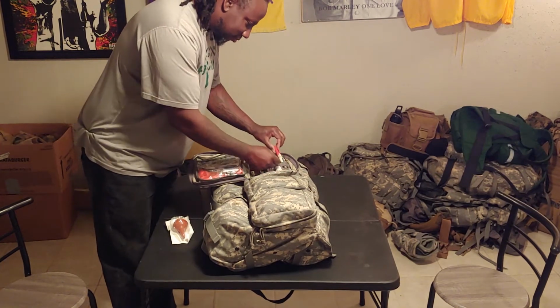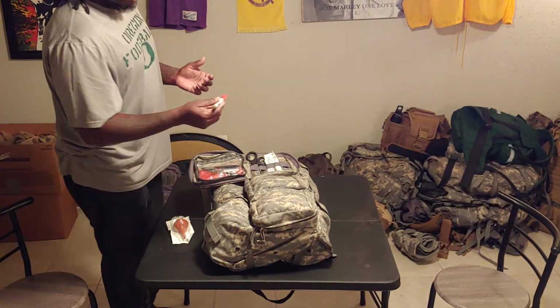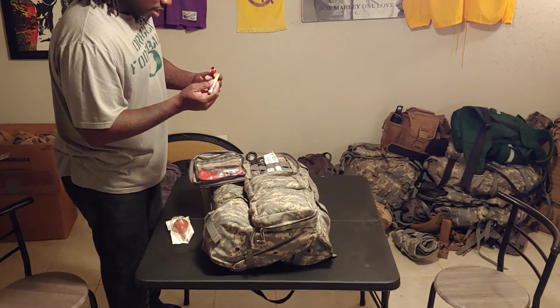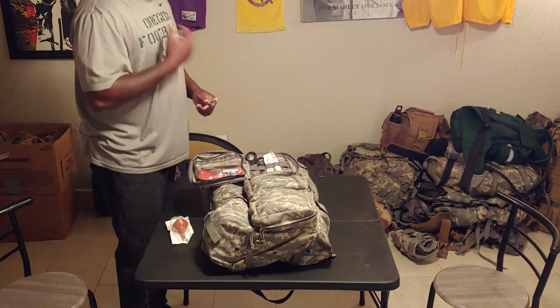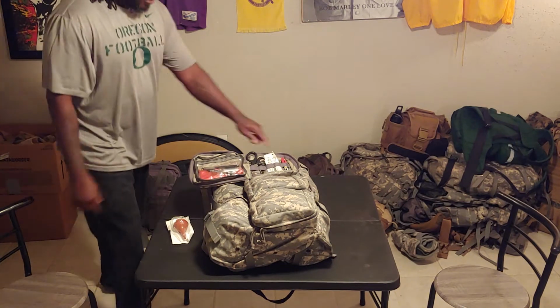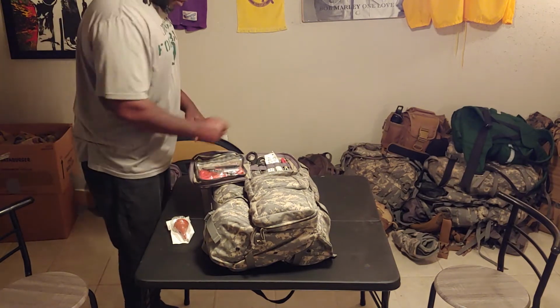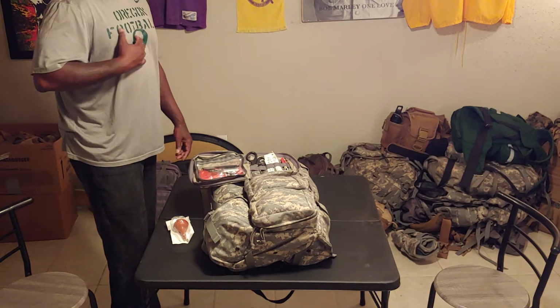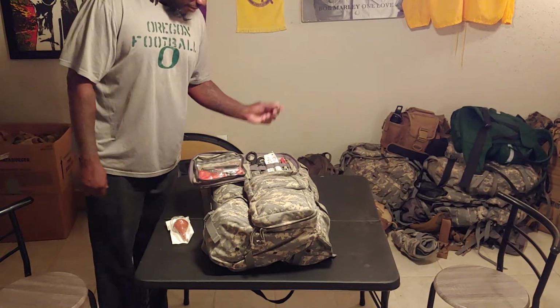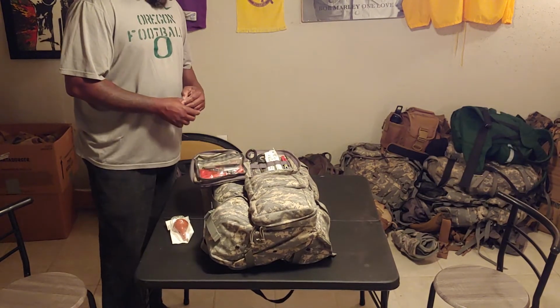What else? What is this? I think this is another marker. Okay, I'm tripping. I'm glad I'm going through this bag. I thought this was a marker, but this is my decompression needle. I need to watch another video on how to use this. It's for when they have fluid or blood building up in their lungs or air building up in their chest. You've got to stick that in the chest or the lung area right in here and twist the knob that's on there and relieve that air that's building up. Otherwise, I don't want to say it can explode, but it's not good. That's why I do these videos too. It helps me go through my kits, and I need to refresh myself on those.